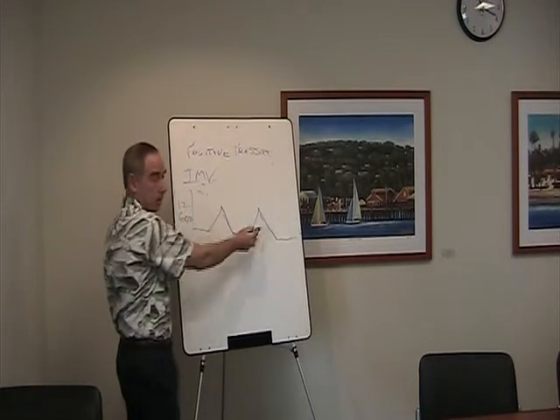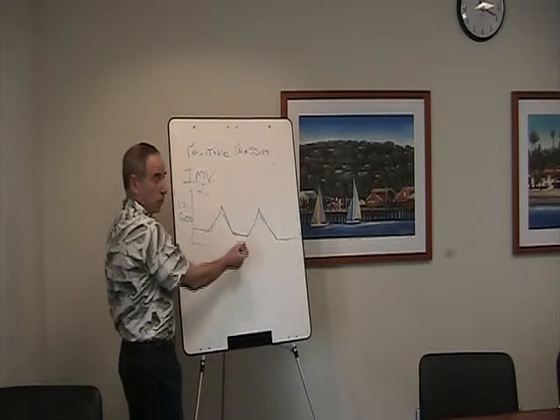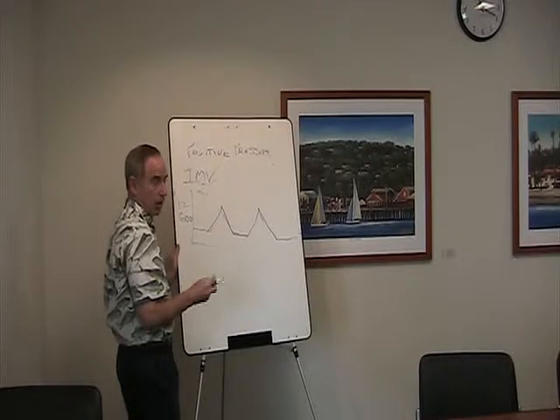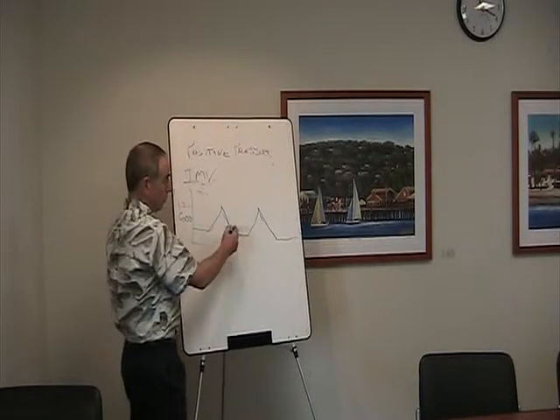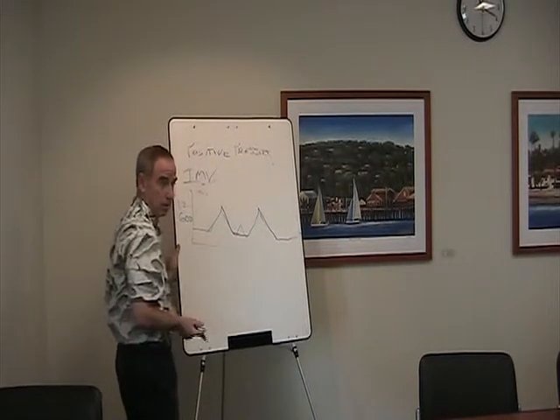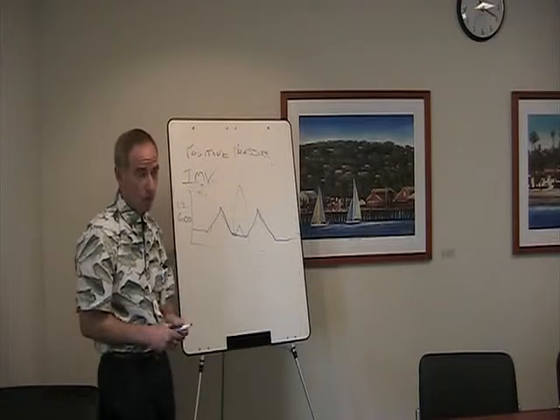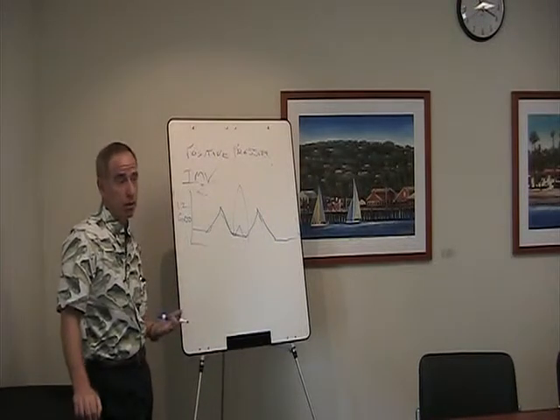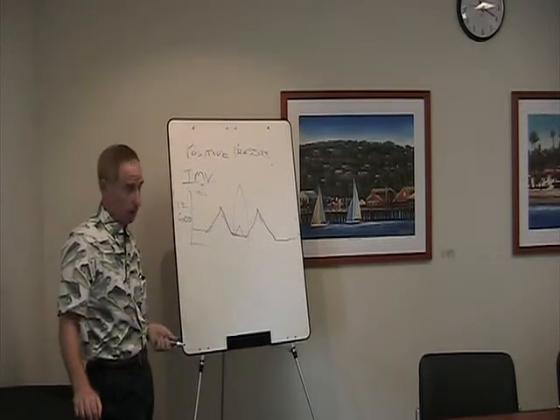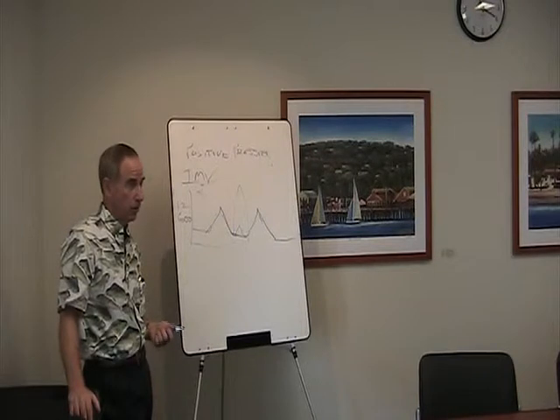They'll get, every 5 seconds, a 600 cc tidal volume. And if they try and take a breath in between those set breaths, what are they going to get? Whatever they can pull on their own. That could be a little volume if they can only take a little breath, or it could be a big breath, bigger than your set breath. It could be a liter or more. They get whatever they can generate on their own, but they're not going to get your set volume like they do in assist control.